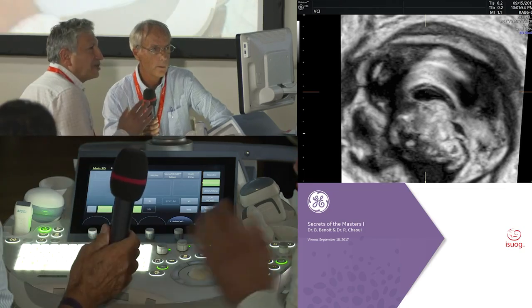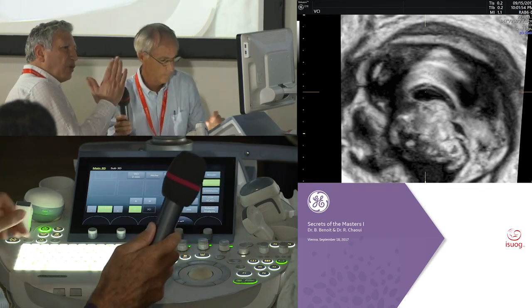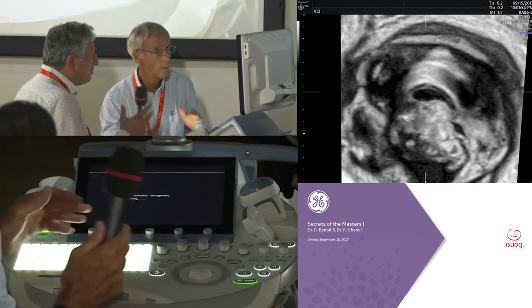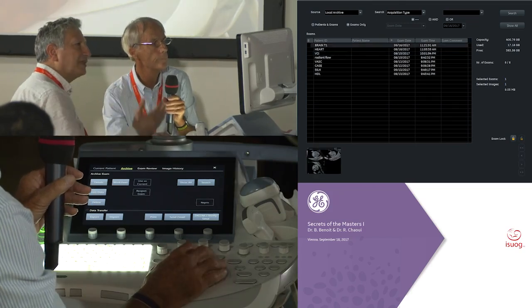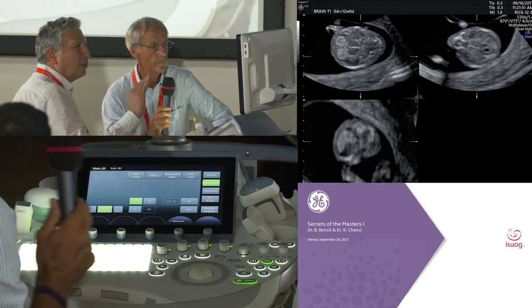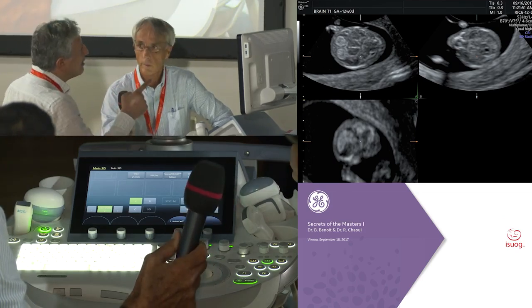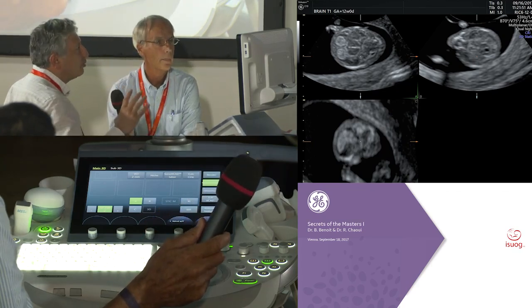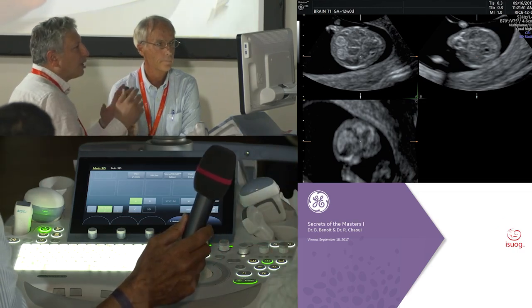This can be an advantage if you are in very, very tiny structures like early gestation, where a slice may be so close, overlapping different information from the images. So, let's say in general for the corpus callosum I try to get a direct view, but I use this occasionally. For first trimester brain, I use almost always multiplanar mode when I'm scanning transvaginally. Because if you scan transvaginally, there is zero chance to get reliably within a few minutes a perfect view to demonstrate the intracranial translucency or the brain structure. So you will always be struggling with the baby.